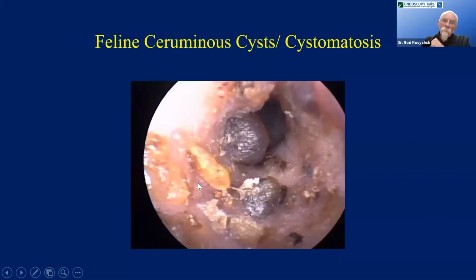In the ear, actually, if you pull away the cystic structure right to the base, pretty much as I just showed you in that dog ear, actually our incidence of regrowth tends to be low with these cysts.